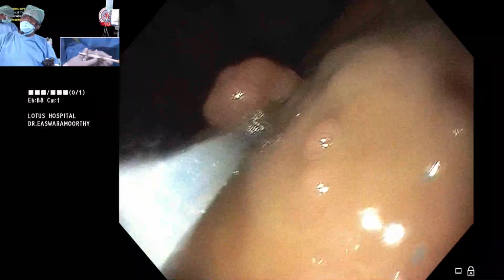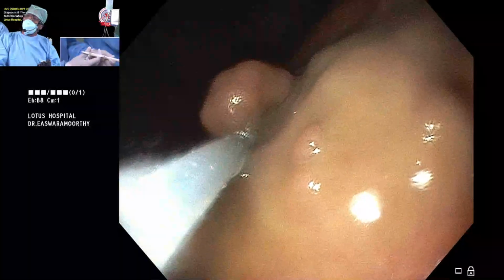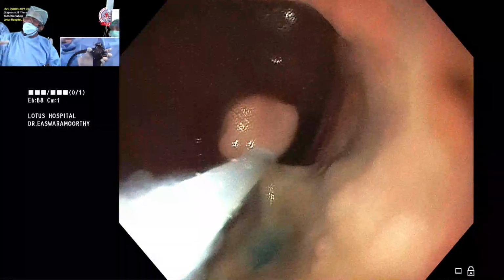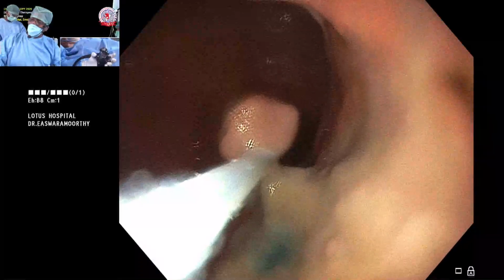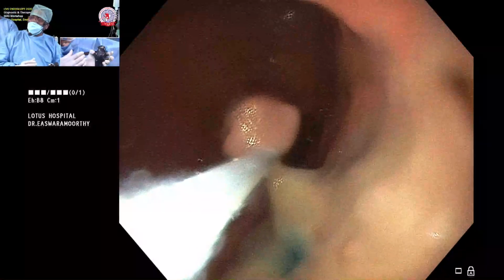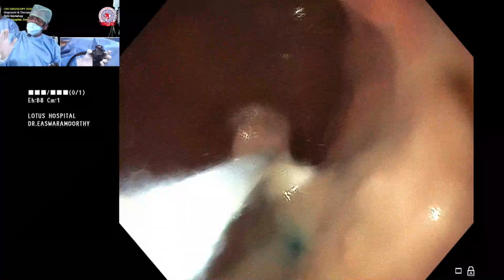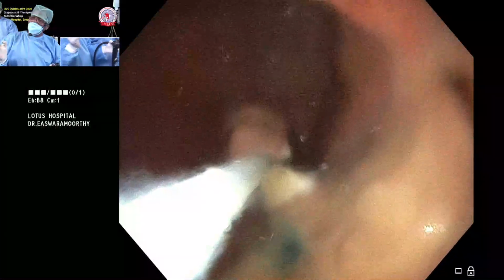Now I have to lift it away from the surface. So what I am doing is, big wheel again towards me. So when I take it towards me, you can see the whole thing is lifted. You can see the small mountain appearing. In other words, you have created what is called a pseudo pedicle by injecting, by lifting. Now you are cutting it, and this is not chopped like that. Tuck, tuck, that is cut interval, and she is slowly squeezing, little by little.